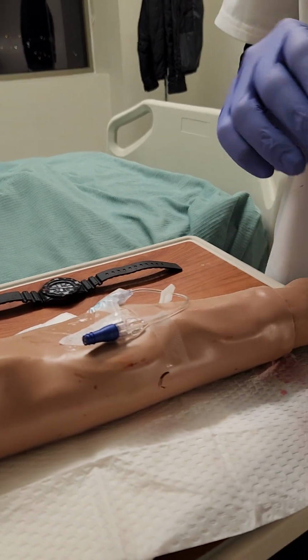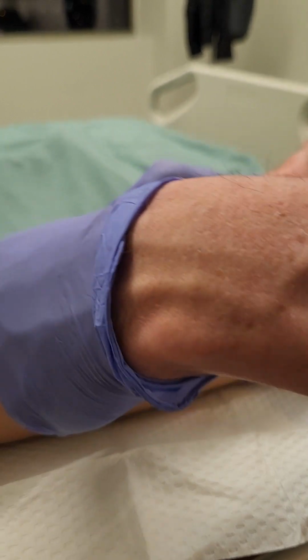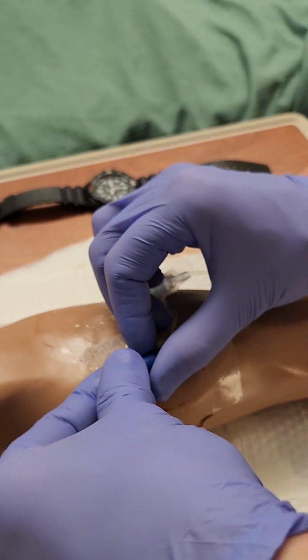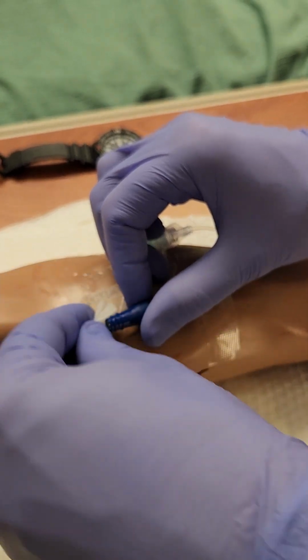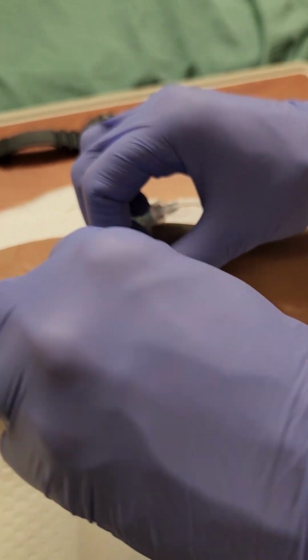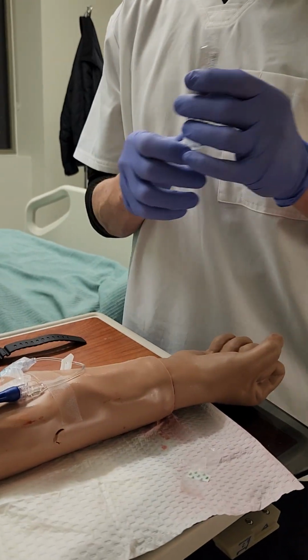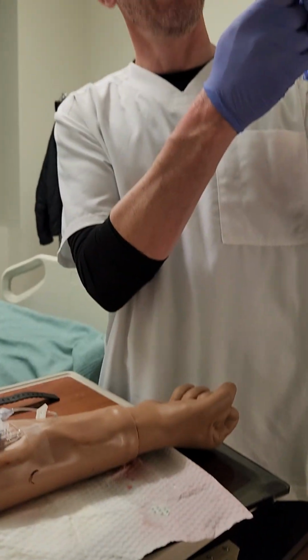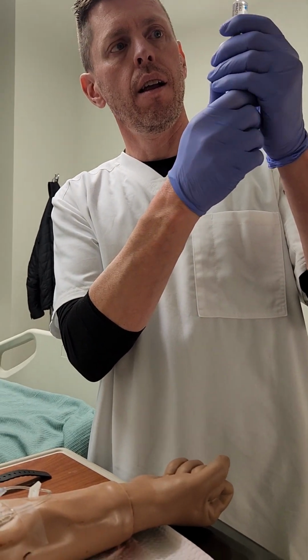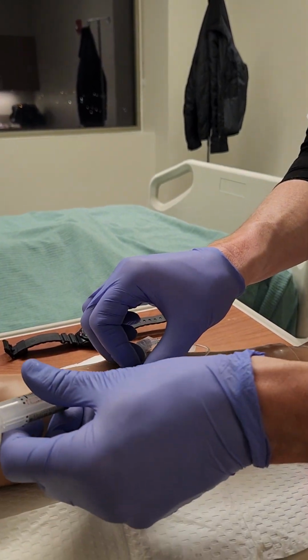Because that's what we do around here, try to keep things clean. It's a hospital, man. Nicely done. Throw that one away. All right, now I'm going to try to give you two more milliliters over the course of 5 minutes.